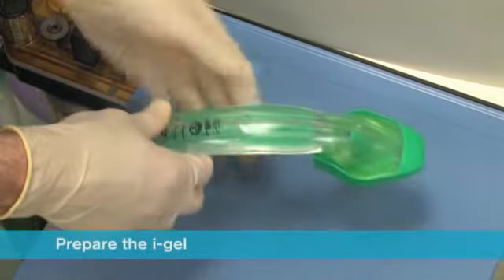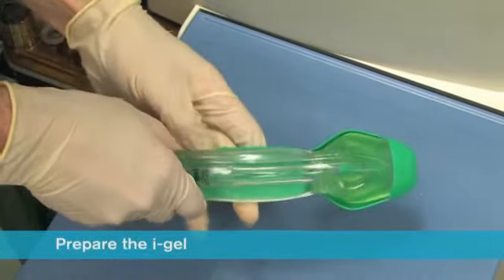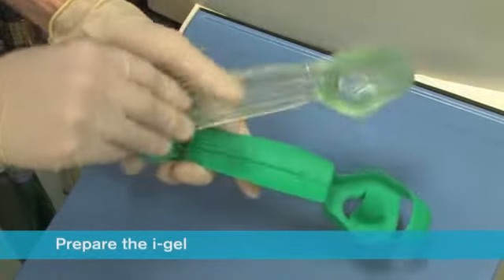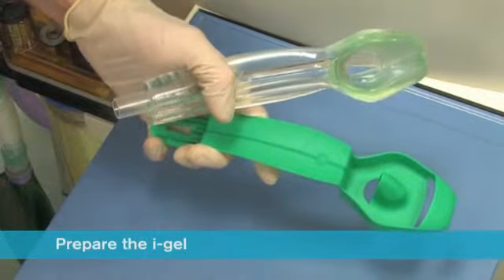In the final minute of pre-oxygenation, remove the iGel and transfer it to the palm of the same hand that is holding the protective cradle, supporting the device between the thumb and index finger.